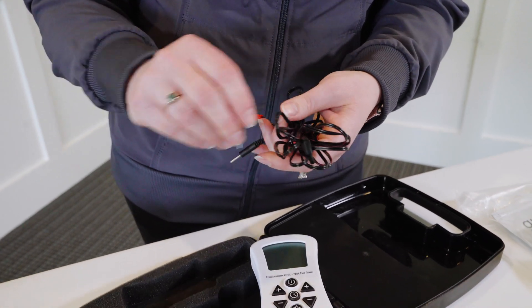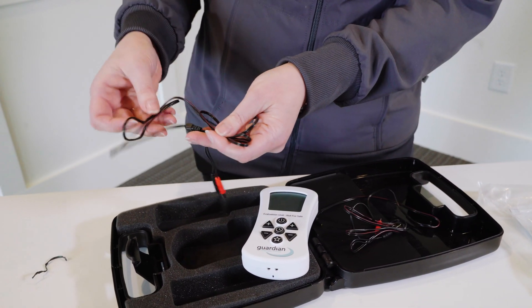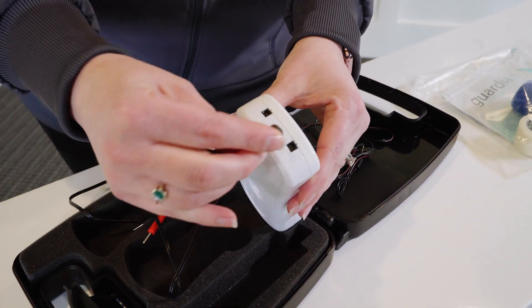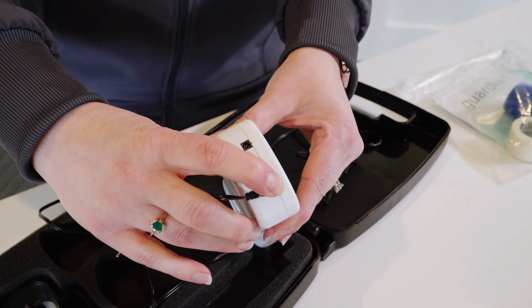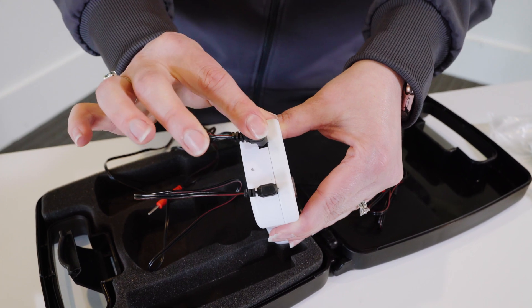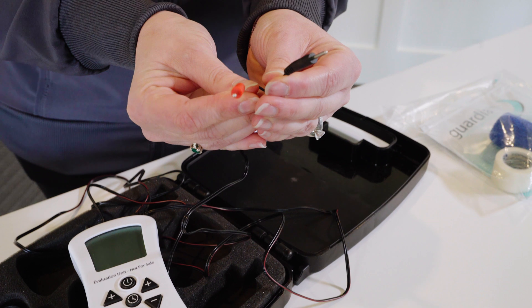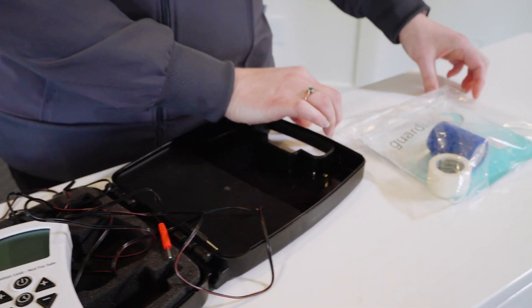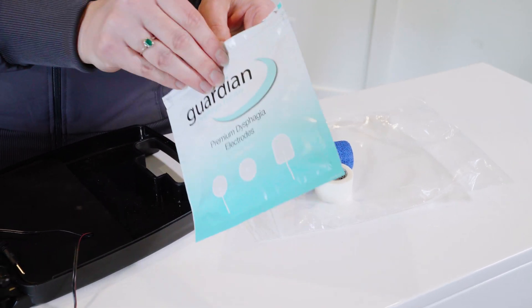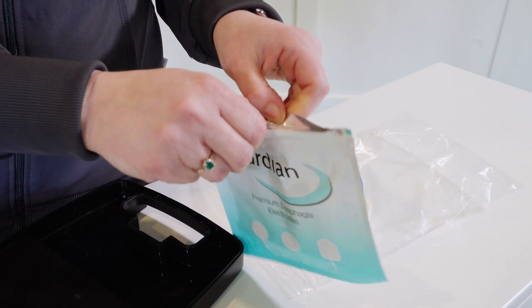This device comes with two sets of lead wires because it has two channels of NMES available. You can use one or both at the same time. You'll connect right into the top and it snaps into place. Each set of lead wires will connect to two electrodes. Those electrodes are going to come shipped in your bag, packaged in triple-laminated foil bags to really keep the moisture in, so always make sure you get those zipped and sealed back.